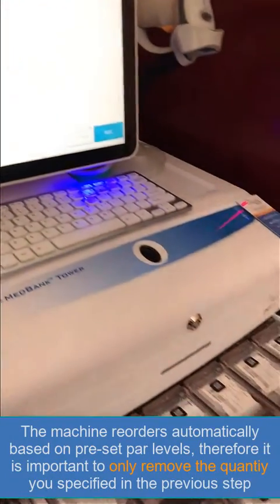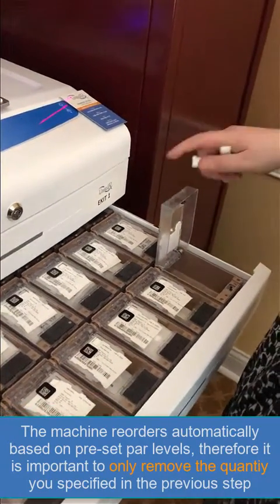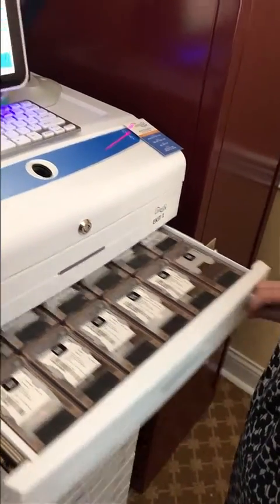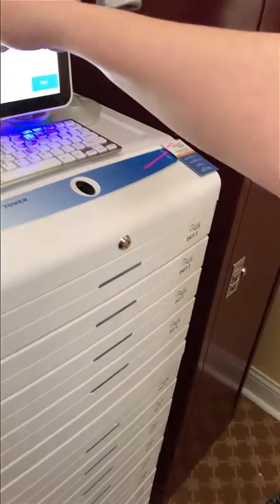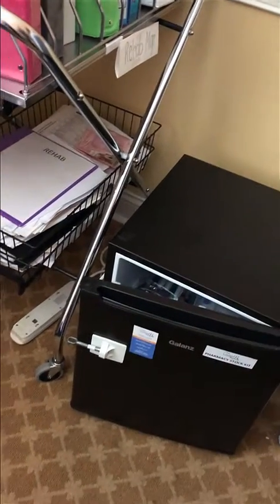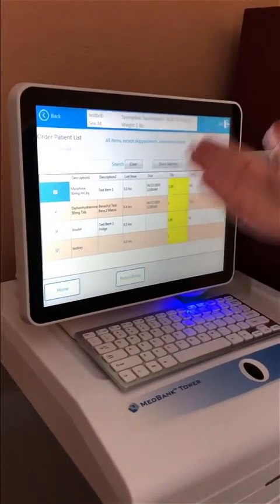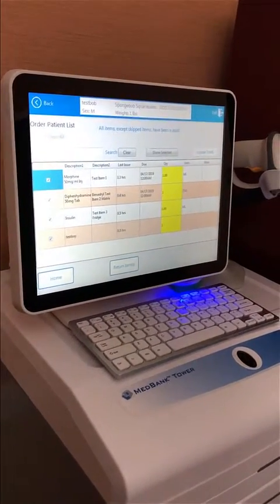And our regular medication opens up, our diphenhydramine. So we'll grab our one pill that we need, close it, and hit next. Now it's telling us our remote item is located in the refrigerator. So we'll take our refrigerated key, go over to the refrigerator, and take out our medication that we need. We'll hit next. All right, so we've issued all of our items that we needed for SpongeBob.